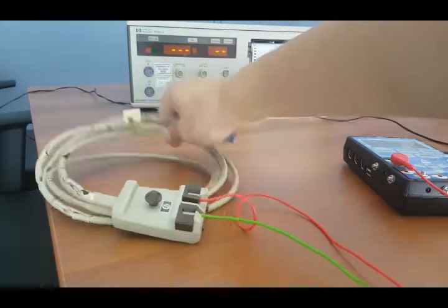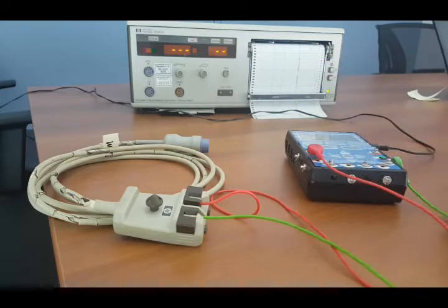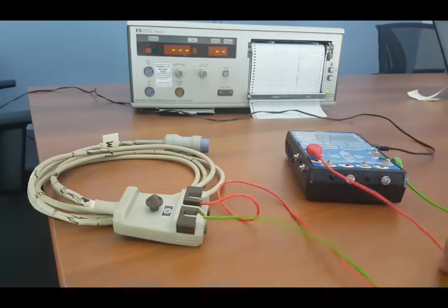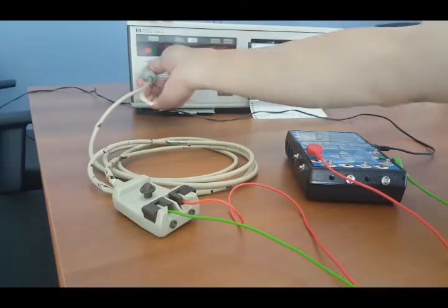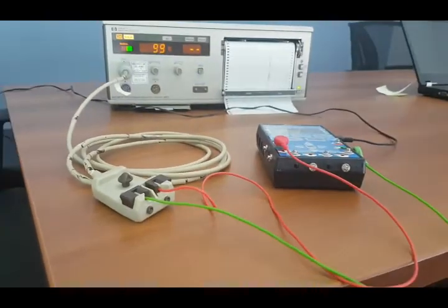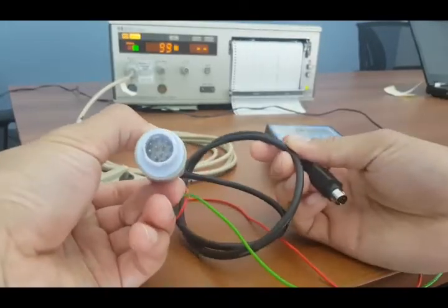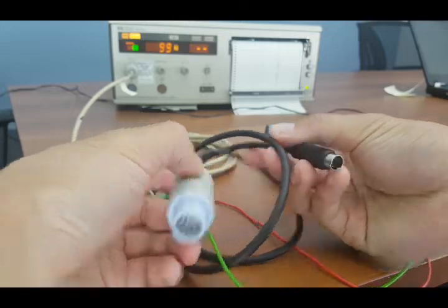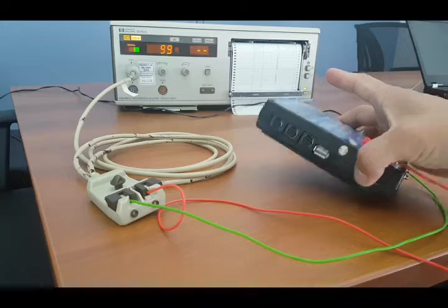Now here I do have an ECG cable, and it's already pre-connected to my simulator, as you can see. So for now, I'm going to connect this cable into the ECG port. To help me with my demonstration, I have two other cables. Number one, I have the ultrasound input, and the other side of the cable, of course, connects to any of the three ultrasound ports.